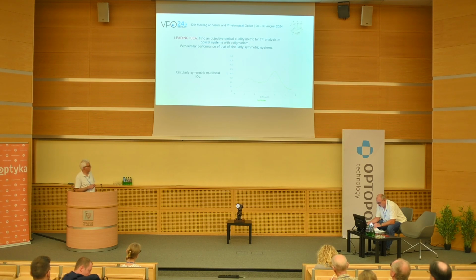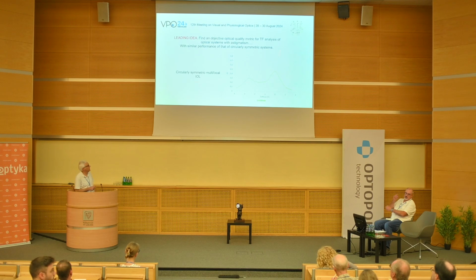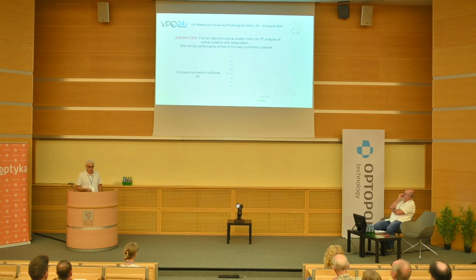The industry of IOLs, ophthalmologists, etc., are used to working with this kind of curve that says, for example, that in a multifocal IOL, at the far focus, or at the designated power of the lens, we have quite good quality vision, and in the near focus we also have some quality. Here is a photo. They interpret these curves in different ways. But what happens when we are dealing with toric lenses, with an astigmatic system? We do not have any equivalent curve of these two.